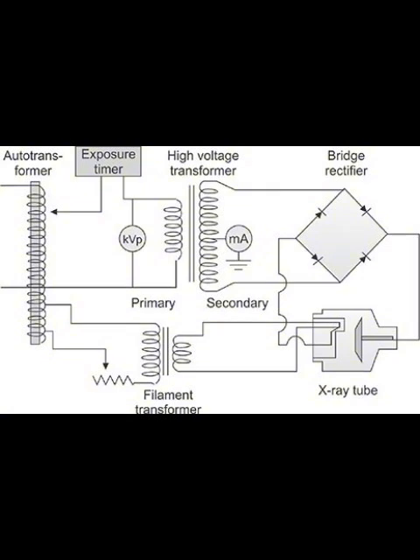So the primary circuit feeds the step-up transformer. Exactly. It prepares and controls the voltage before it gets massively boosted. It's all about control on this low voltage side. Okay, so the primary circuit sets things up, then that voltage goes into the step-up transformer, and the output of that transformer belongs to the secondary circuit, which is the high voltage side, yes. This is where the serious power lives.